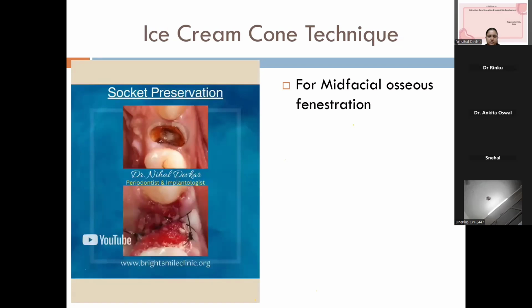And then, after the usual biomaterials for grafting, for extractions, you can use normal luxators and forceps. You need normal saline to irrigate the wound, a curette to debride the area, and later on for closure, you might need a monofilament suture material to close the top of the wound. That's it.